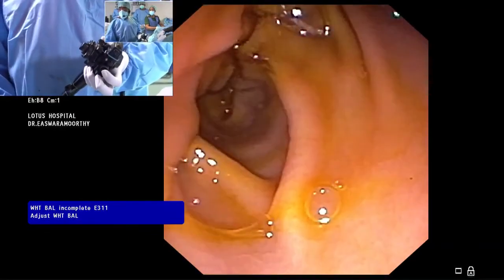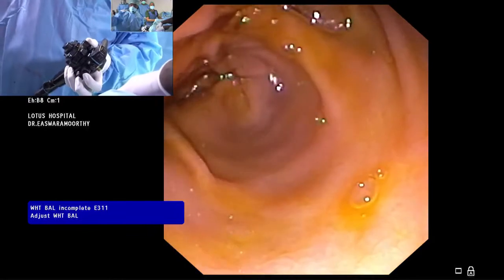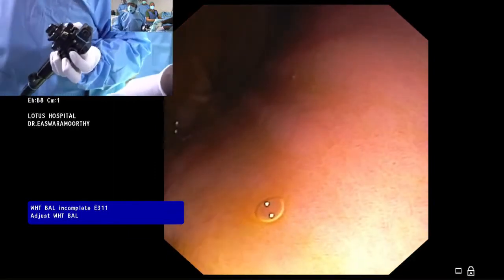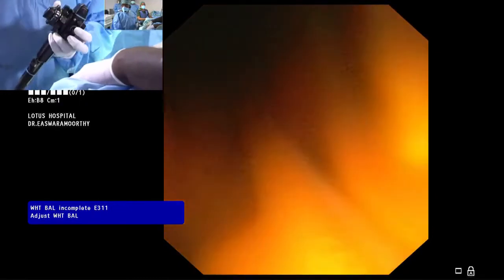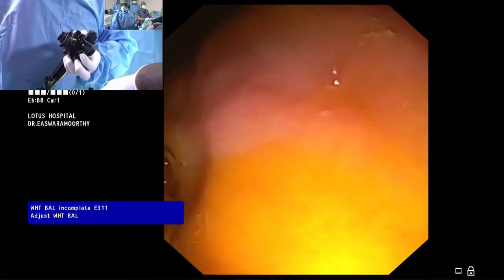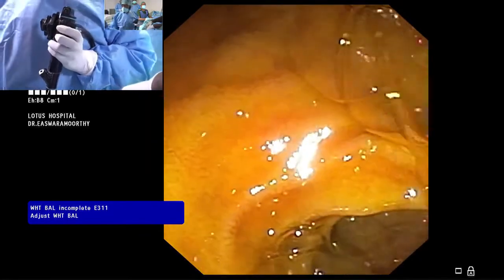Sometimes bile will show that you are nearing that area. So you can see here some antrum, the converging mucosa, and presence of little bile. It will tell I am just nearing. You bring the pylorus to what we call a sun setting position in the long route. So this is what I am doing. I have already done that. This is the pylorus disappearing under me. This is the first part, second part duodenum.